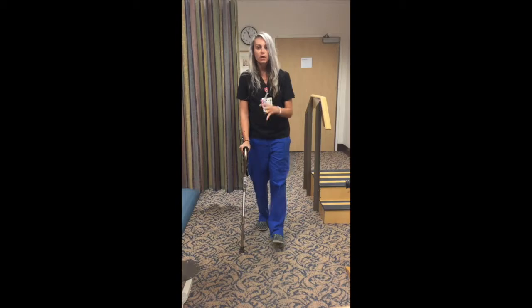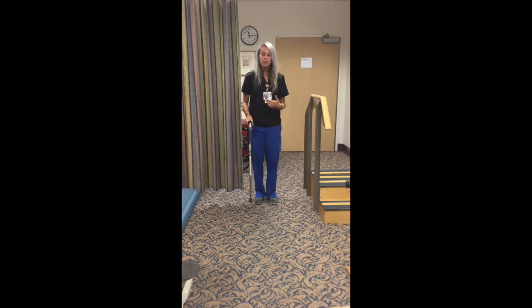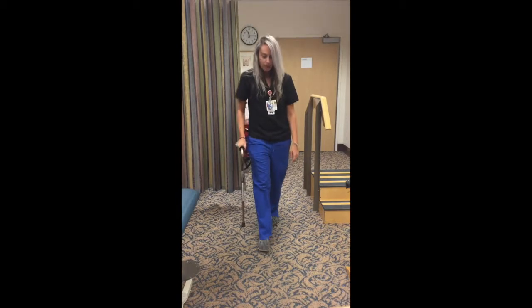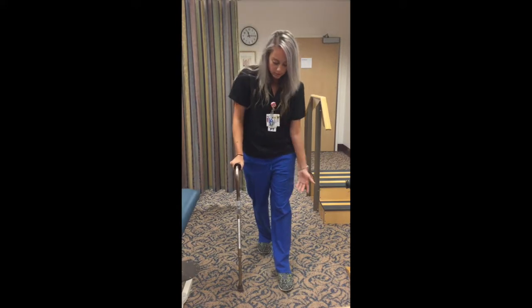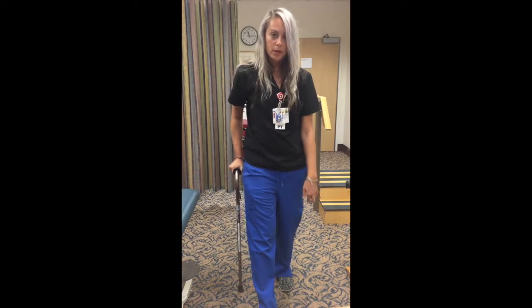Once you get the hang of that body weight shifting, and you're comfortable with being able to use the cane in the opposite side of surgery, then you're going to try to hit the cane at the same time as your operated foot and swing all the way through with your good foot. Okay, so again, this is acting as another leg, a little bit of support for that side for balance. Okay, so operated foot with the cane, and then swing through with your good side.